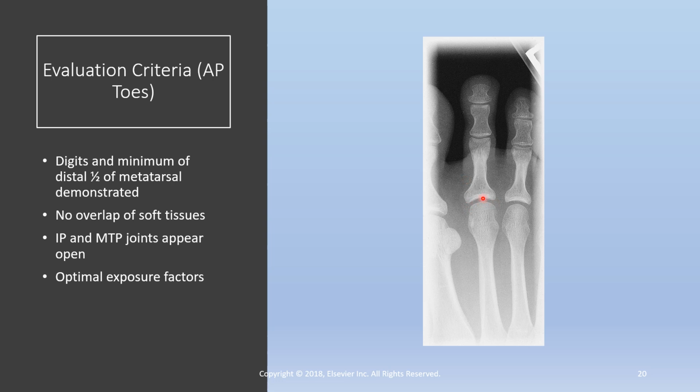So you've got metatarsophalangeal joint here, and then you've got proximal interphalangeal joint and distal interphalangeal joint. And this is second digit. You can see the sesamoid bone right here, and since it's the one to the lateral, this would be the fibular sesamoid. The marker placement on there is not really that great. I feel like we can tell that it's a right, but if that was the case, I feel like I would have left the collimation open slightly more to visualize that right marker.